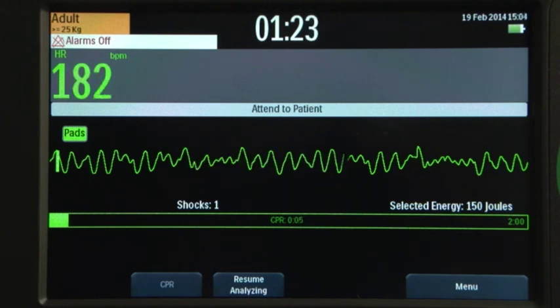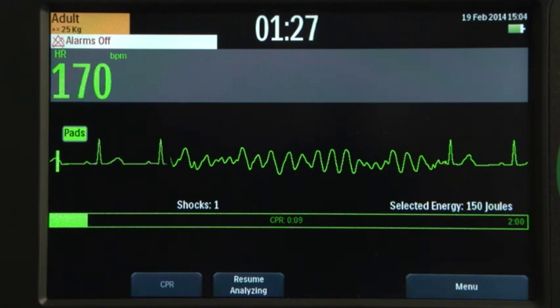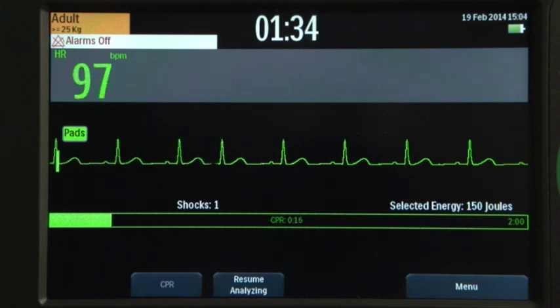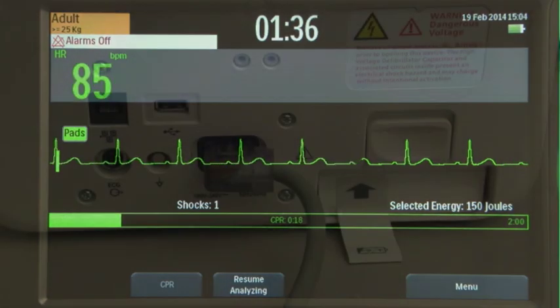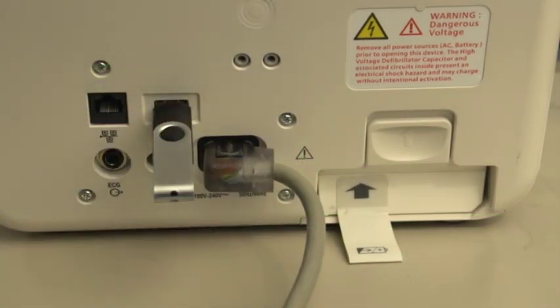Infant child is defined as less than 25 kilograms or less than eight years old. The device incorporates Philips low-energy smart biphasic waveform for defibrillation. The DFM100 automatically stores critical event data from all four modes for later transfer to a USB drive and download to Philips data management solution, HeartStart Event Review Pro.